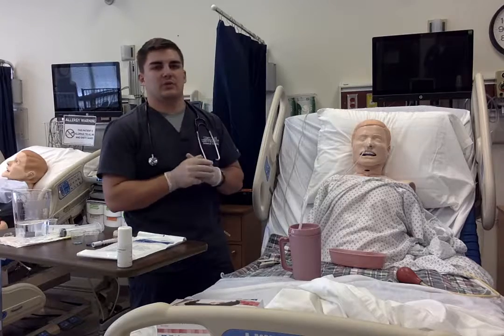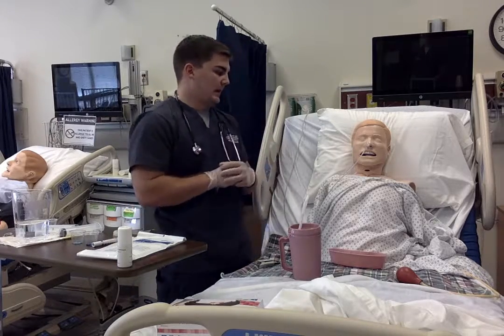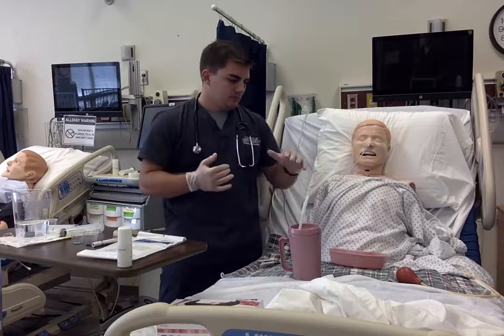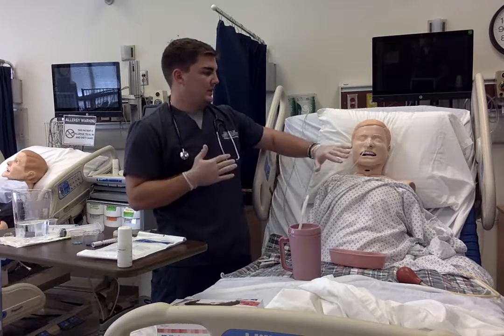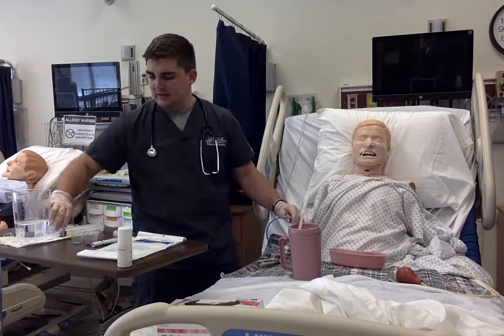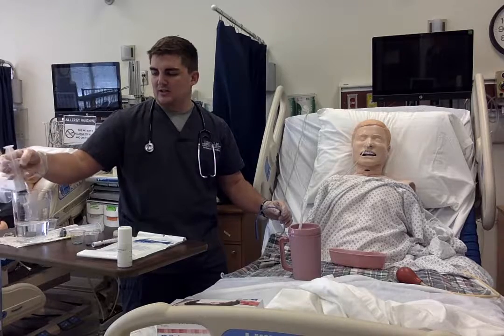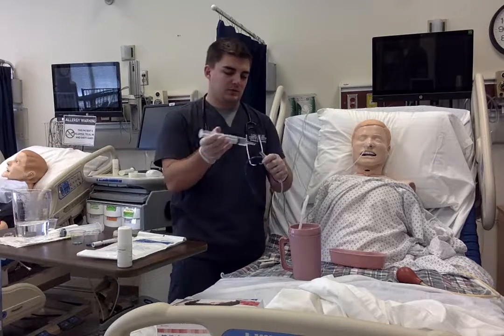I'd verify the orders with the physician that these are the correct orders, and assess any drainage or leakage around the patient's nose and whether there's any irritation. Before I remove the tube, I would instill approximately 10 to 20 mils of water to make sure it is patent.